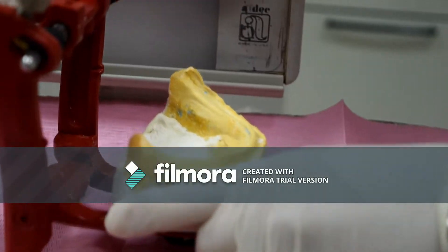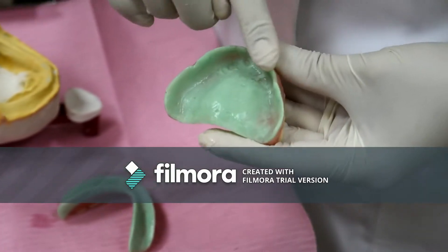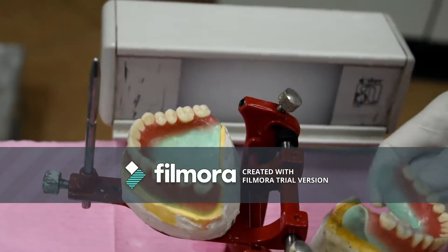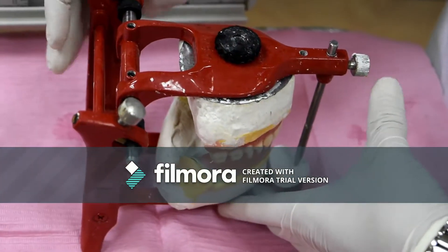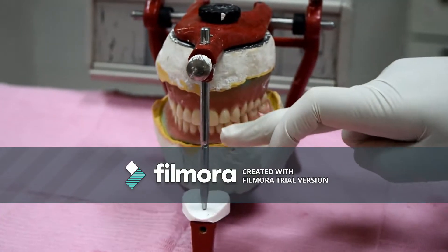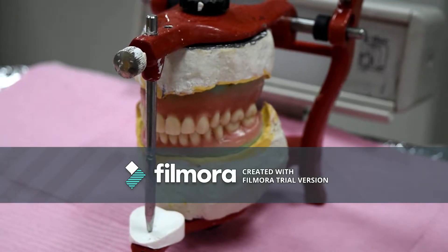Also, the try-in denture bases should be free from any wax and from any scratches. They should also have rounded edges — any sharp edges shouldn't be present. The artificial teeth should be checked to be of the properly selected shade, size, and shape. There shouldn't be any contact between the upper and lower anterior teeth unless an edge-to-edge contact is selected.